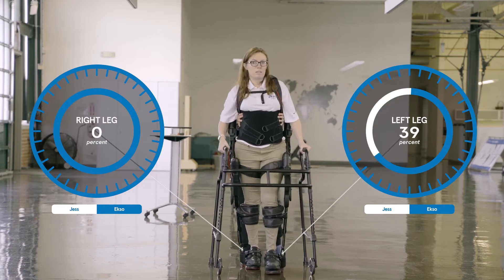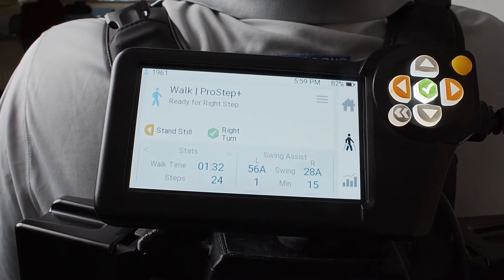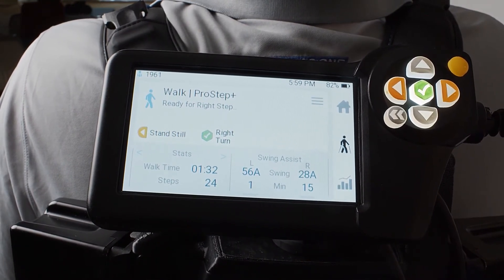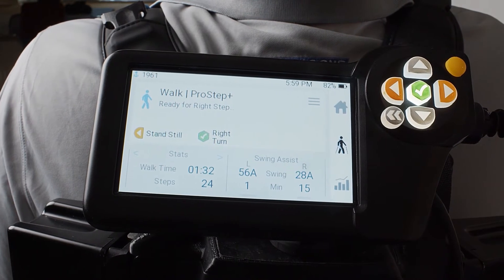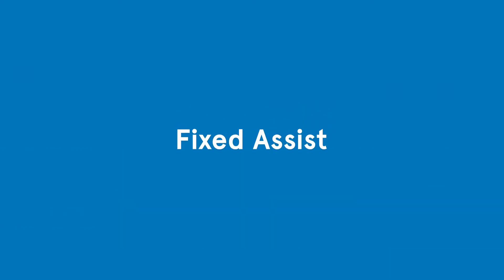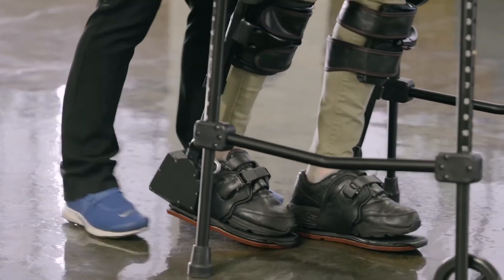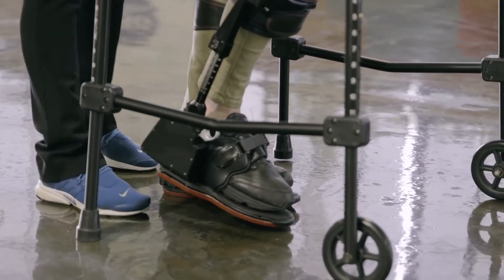Feedback numbers assist the PT in adjusting software to progress the patient and monitor progress, as well as indicating where to start when progressing to Fixed Assist. If a PT wants to alter the patient's motor planning, they can lower the assistance ceiling to make the patient do more throughout the swing phase of gait.